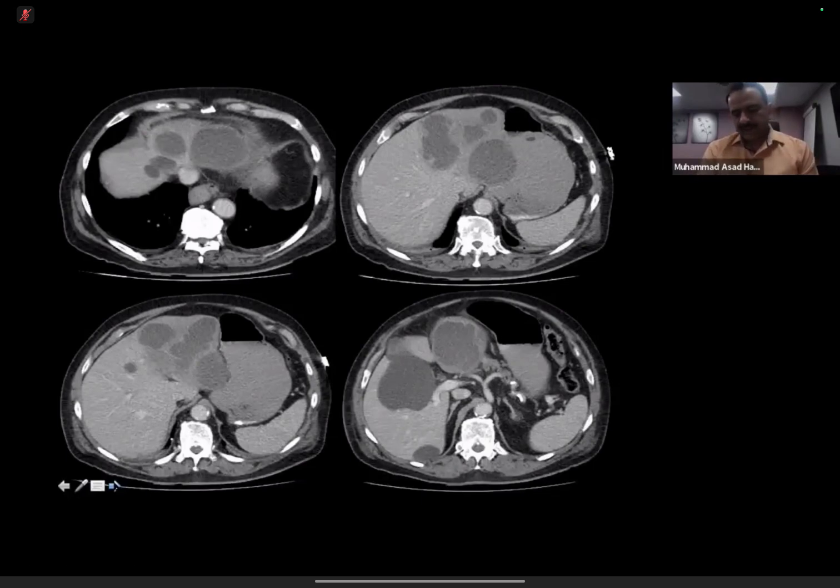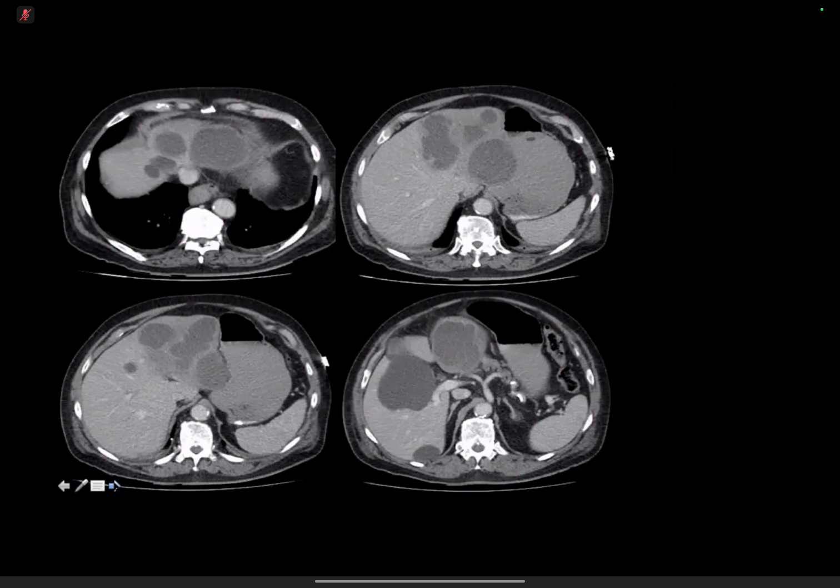Now, once you come to that conclusion with the examiner, usually the next question would be, can radiology help in such situation? So how radiology can help in such situation? So it's perfectly plausible to place a percutaneous drain into one or more of these. I would mention that they are multilocular and in fact look almost separate. And so draining one part is no guarantee that you'll be able to drain the whole, but it might help.